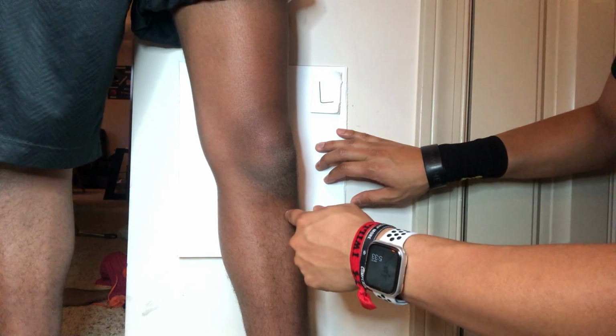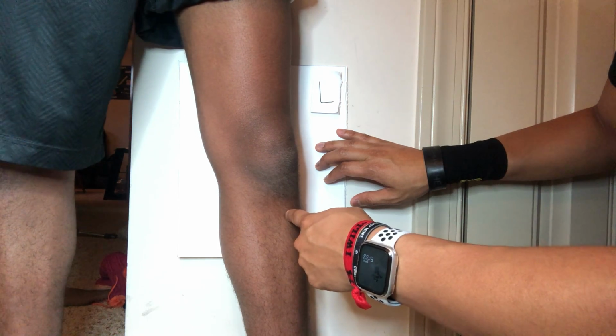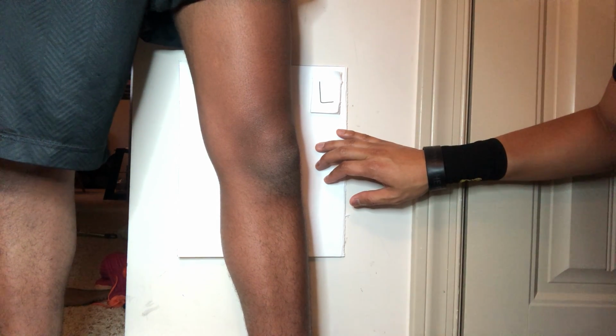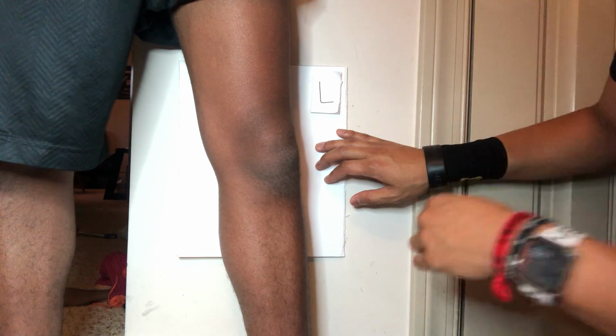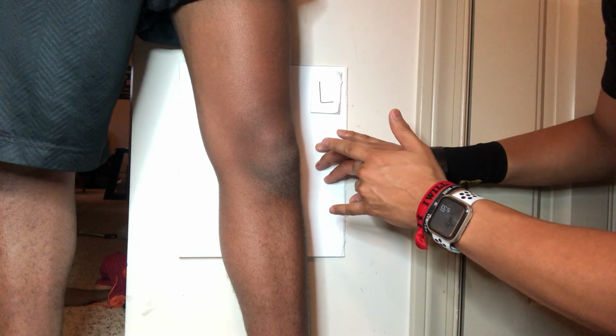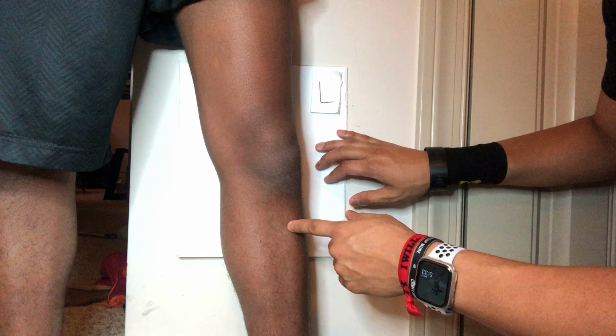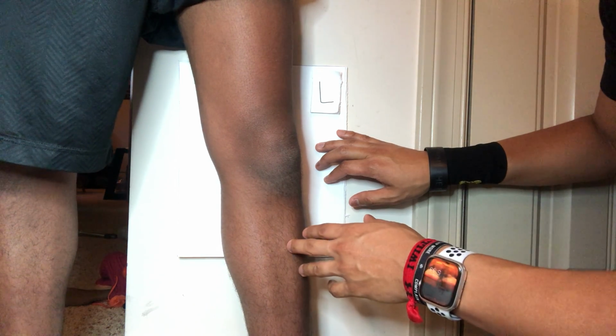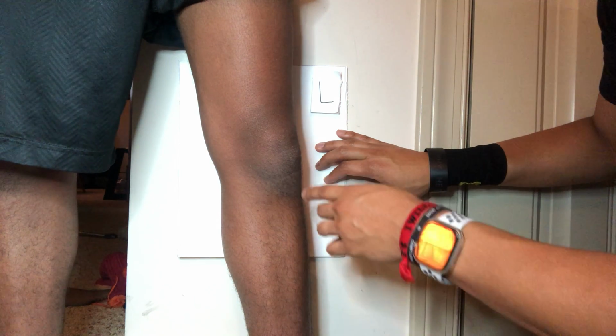Again, central ray is going to be about a ½ inch below the apex of the patella through the center of the film space, perpendicular with the image receptor. We're going to collimate the image to include bone and soft tissue structures of the knee, the laterally rotated femoral condyle, the patella, tibial condyles, as well as the fibular head and neck.